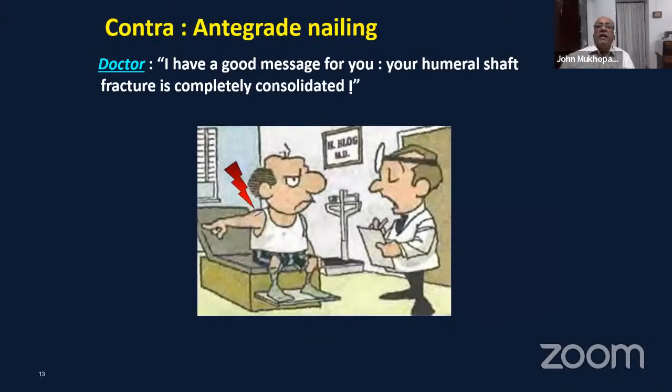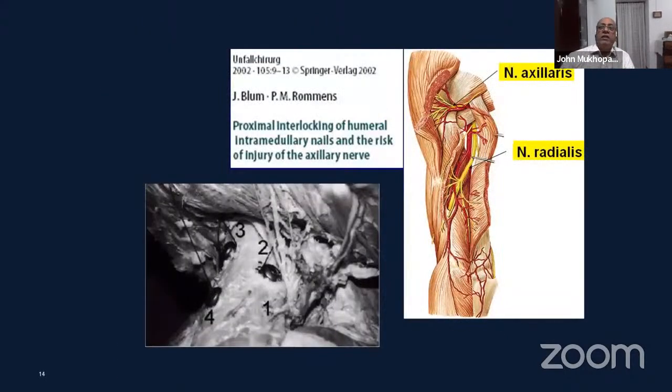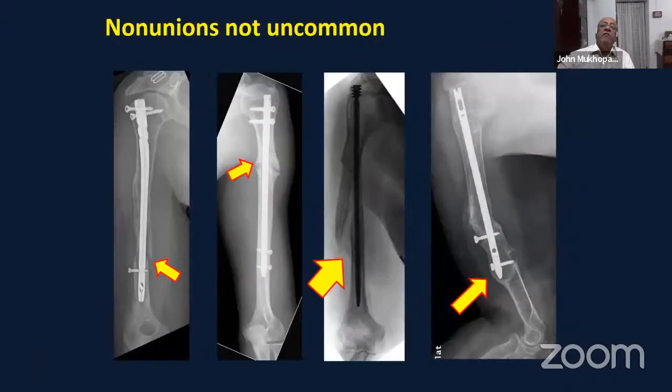This is a classical example where the fracture has healed, but the patient is not happy because his shoulder is hurting, and it didn't hurt before the surgery. The other thing is you have to be careful about some of the locking screws, which may be very close to the axillary nerve as well as the radial nerve more distally.